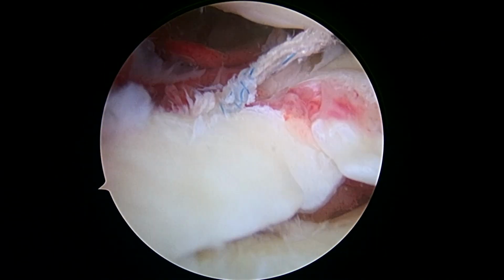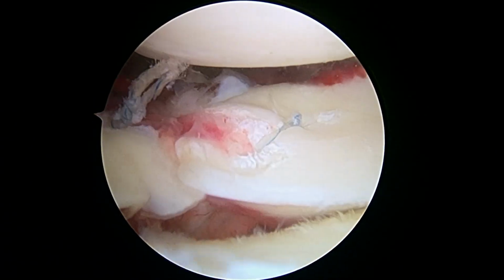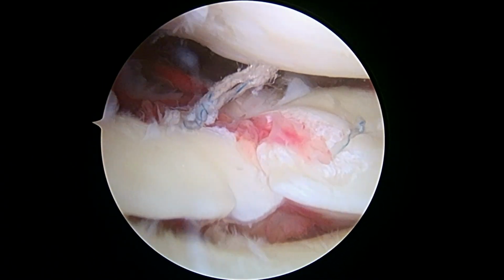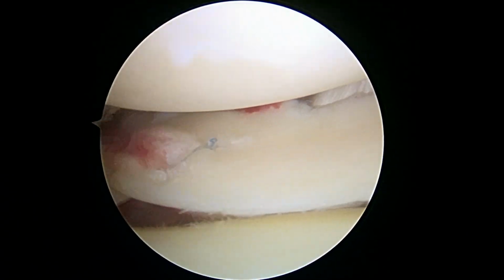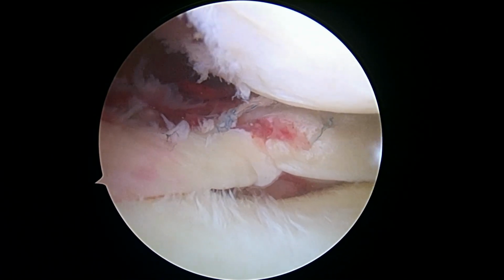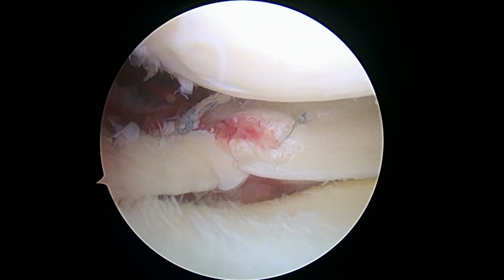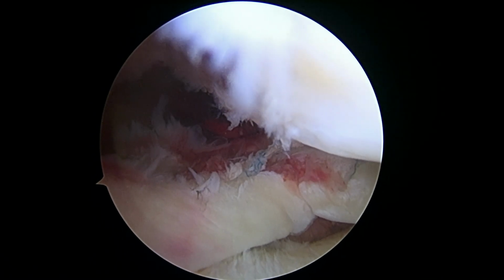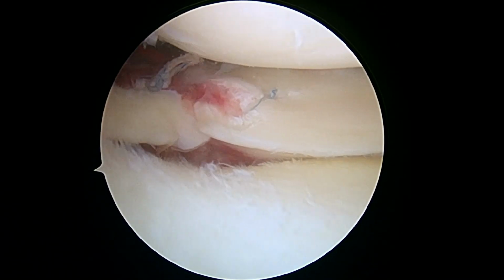Okay, so we've got 2 implants in. One is an implant called Ceterix, the other is called FastFix. And you can see we've got the meniscus approximated. I'm really hesitant to try and put one more suture in because that whole construct could come apart. But at least the meniscus is restored there. And if we can get a little lucky and get that to heal, I think that'll be a win for you. We can talk about augmenting that with one of our biologics in the office later. But for right now, I think I'm going to call that good and leave that alone.